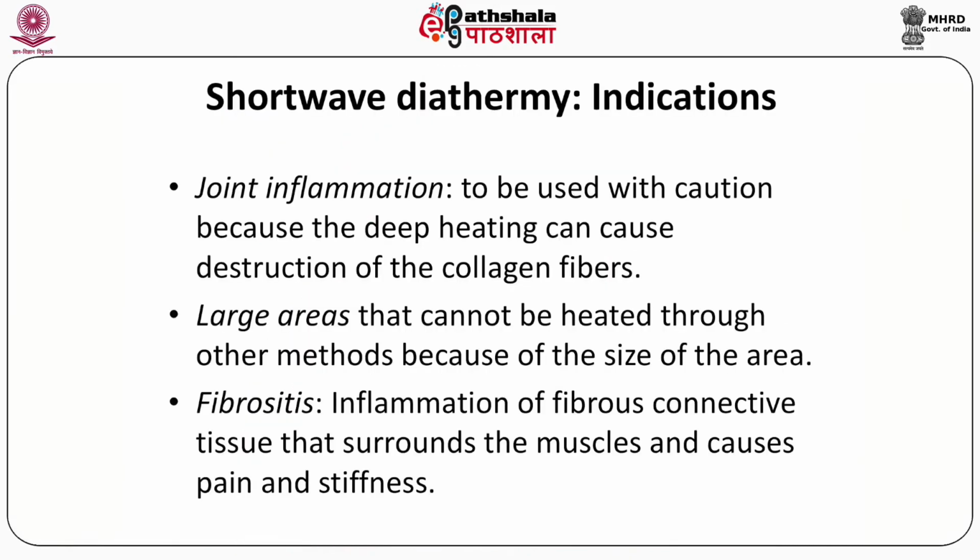Apart from joint inflammation, we have some other indications, like large areas that cannot be heated through other methods because of the size of the area. In those areas we can use this shortwave diathermy. One more indication is the condition of fibrositis, that is the inflammation of fibrous tissue, the inflammation of fibrous connective tissue that surrounds the muscle and causes pain and stiffness. So in these conditions we can use shortwave diathermy to relieve the symptoms.